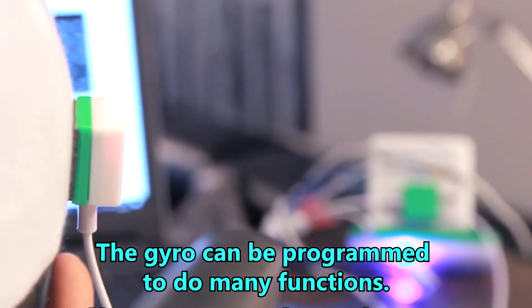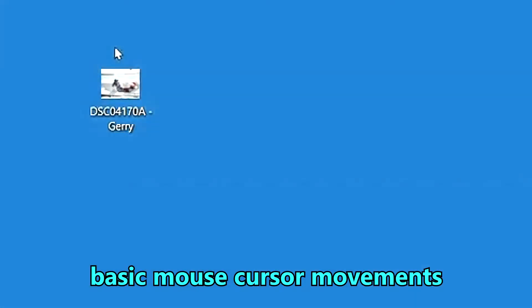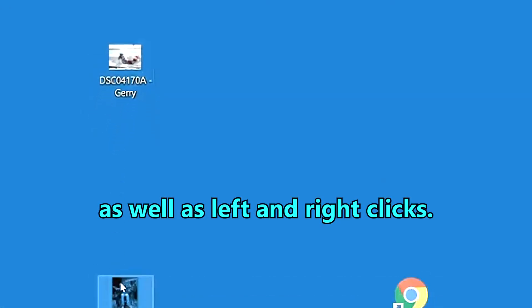The gyro can be programmed to do many functions. Here we will show you how to do basic mouse cursor movements as well as left and right clicks.